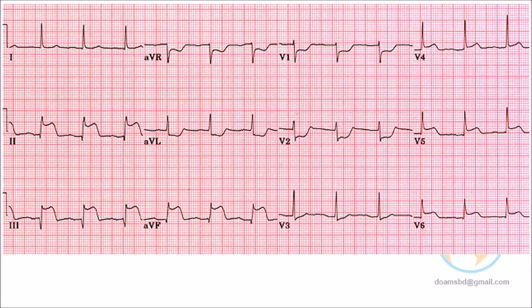So the anterior wall is represented by the chest leads. Okay. So look at V1, V2. What is this? This is depressed, right? This is ST depression. So here is elevation, and there is depression. This depression is termed a reciprocal change. This is the electrical circuitry within the heart muscle. It may be associated with ischemia also, but in the language of the ECG, we will say this is a reciprocal change.